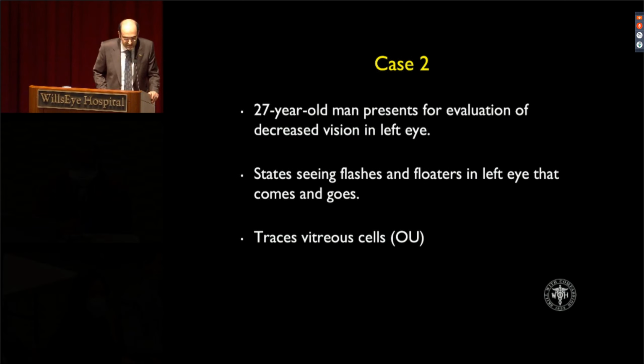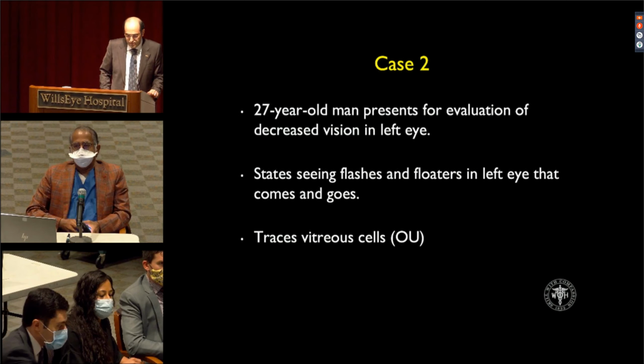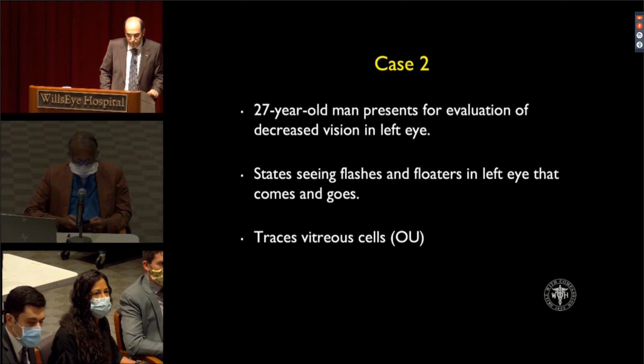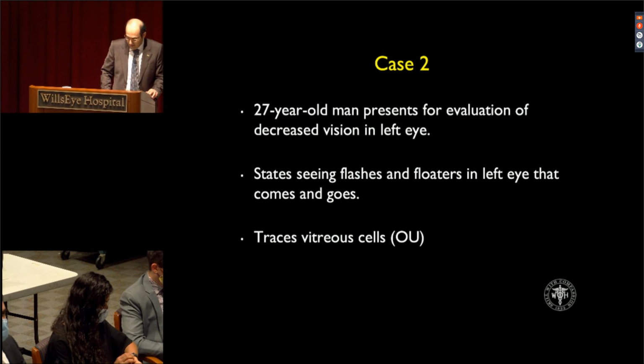Thanks. A 27-year-old man presents for evaluation of decreased vision in the left eye. Our patient states seeing flashes and floaters in the left eye, and trace vitreous cells were observed in both eyes. Dr. Shahlaee, would you please walk us through these cases?